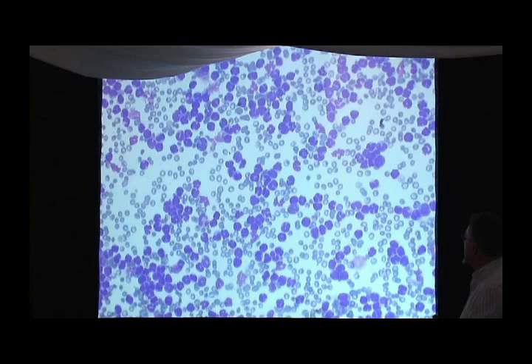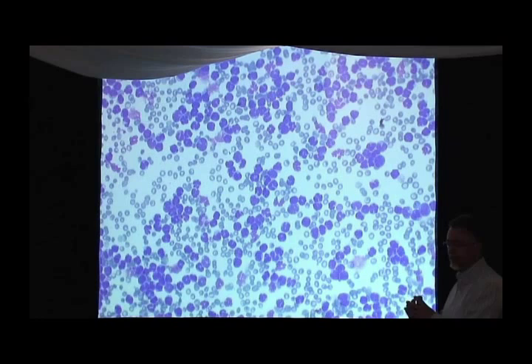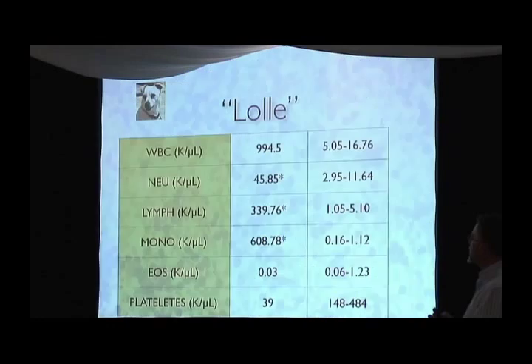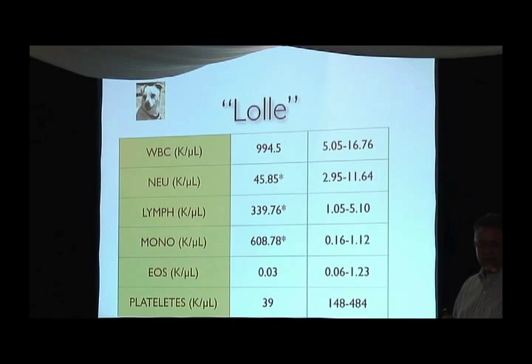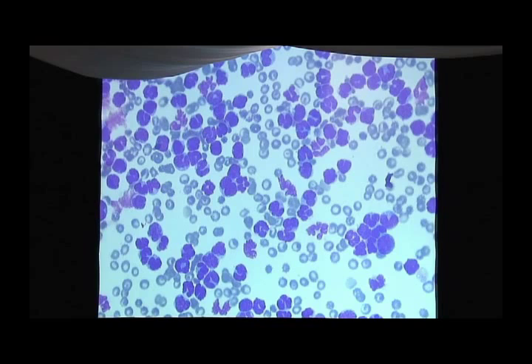So when we started fiddling with this, it was another one of the issues I brought up to Jim. I said, Jim, can you exclude them or flag them if they all live in the same area? Your next version of the software will have that. We'll rerun a bunch of cases through it, and it's really, really good. You're not going to think that a 994,000 count is a bad infection, you're going to say that's really evil stuff, so you're not going to believe the retics.